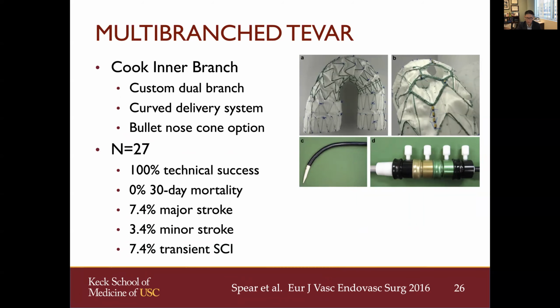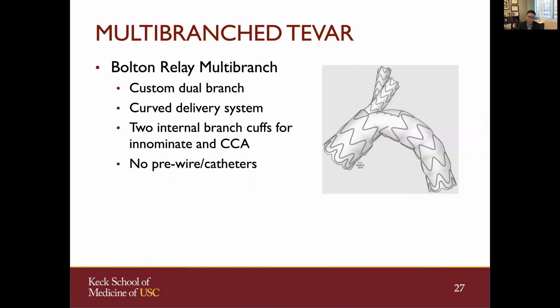Cook inner branch TEVAR was pioneered by Dr. Cherry Abraham, and it is designed to be implanted with a single pass. It has self-aligning features, and no rotational manipulation is performed. However, at this time, this device remains investigational at select PSID centers.